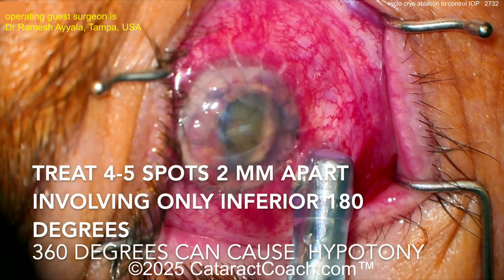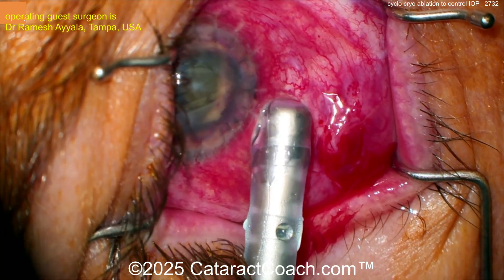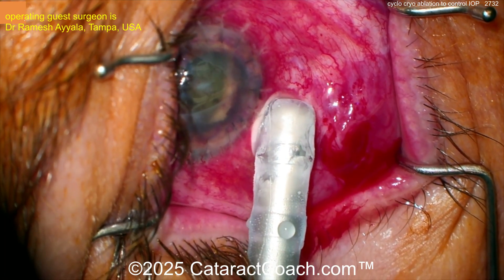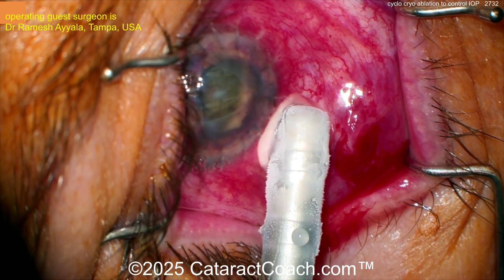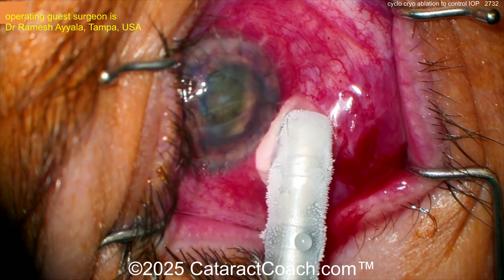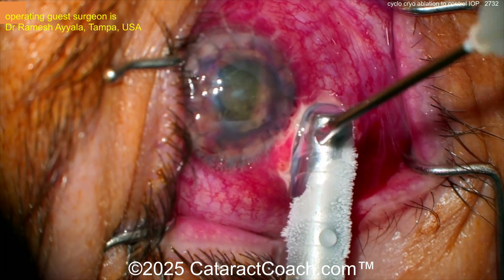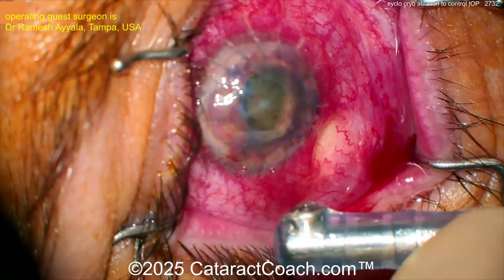Squirt some BSS to help release that, then release it — there's two spots. Four or five spots total, two millimeters apart, only the inferior 180 degrees. If you do more than that, you get a terrible hypotony in the eye. Here's another big freeze spot — take your time. If it's a recalcitrant case, you can go back over the initial spots a little bit longer, but you've got to get the freeze ball for 30 seconds, because you want to freeze the tip of the ciliary process where you're making the aqueous.